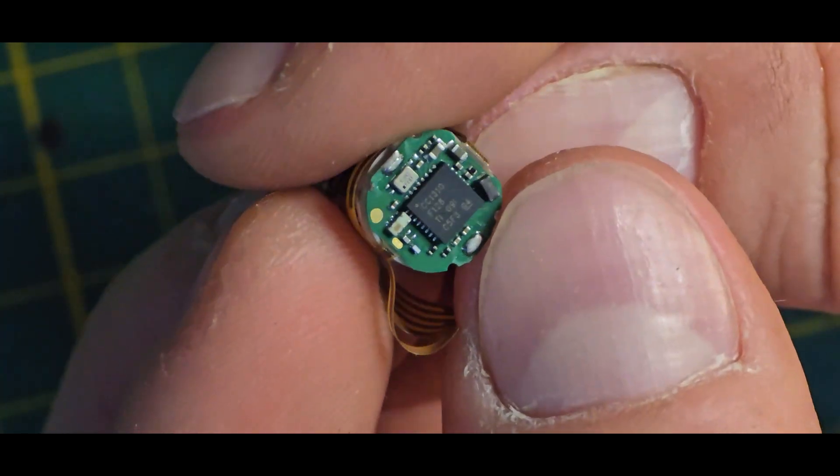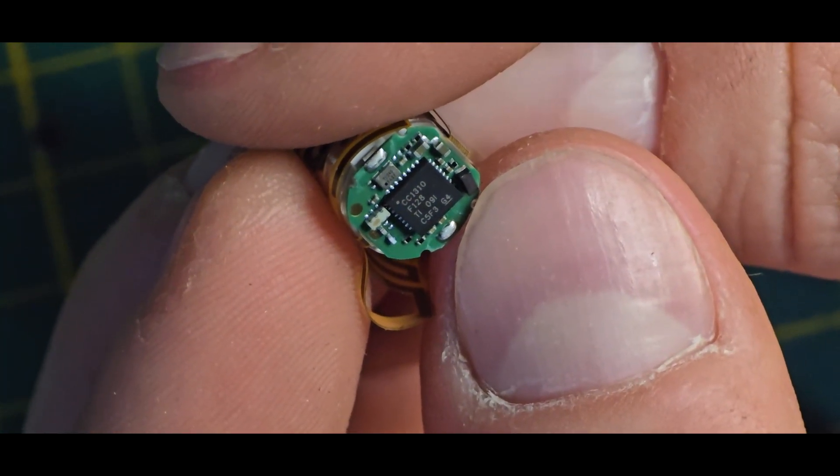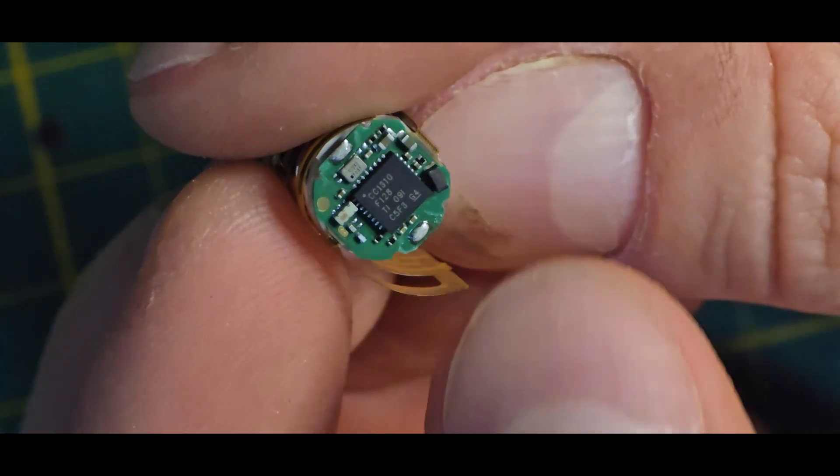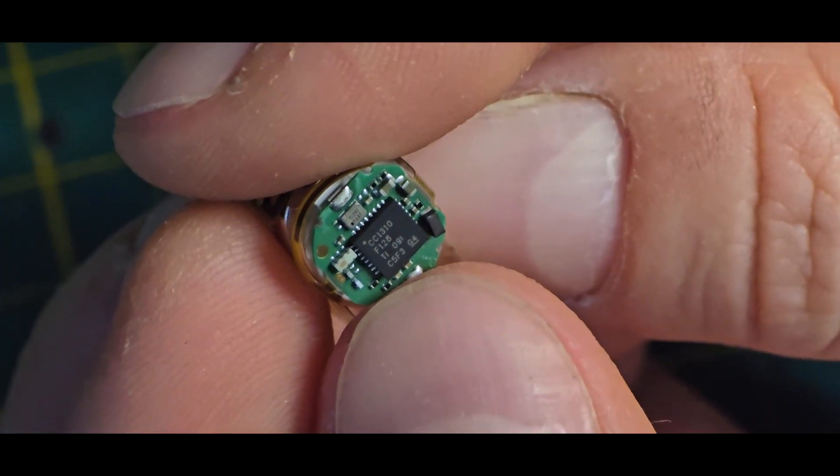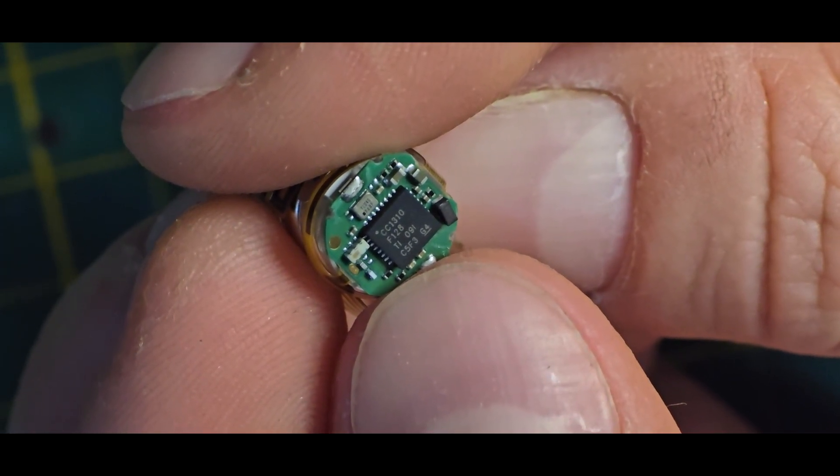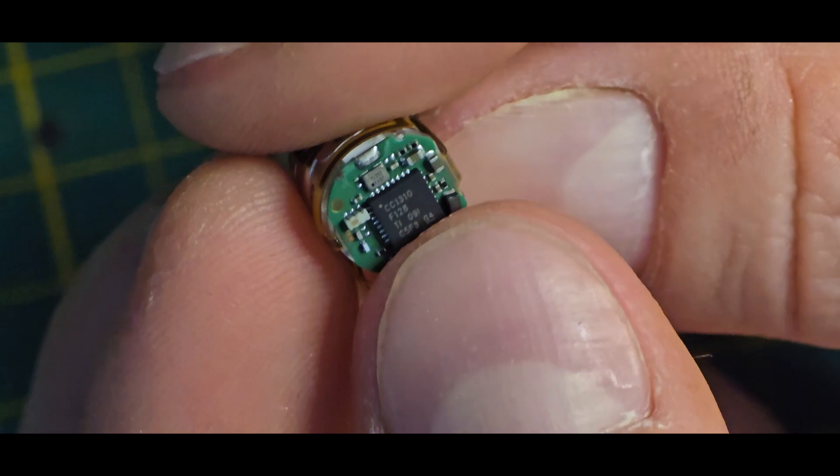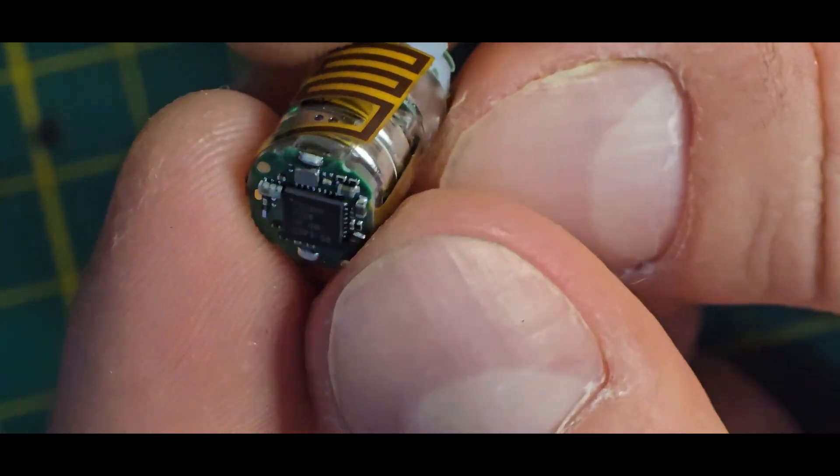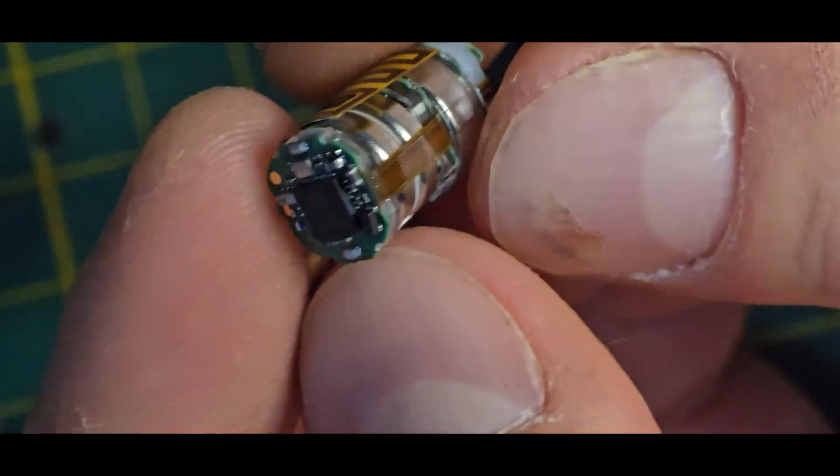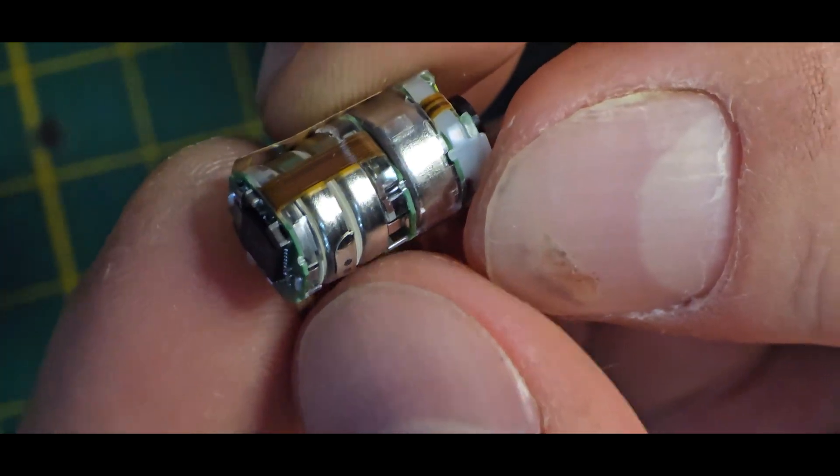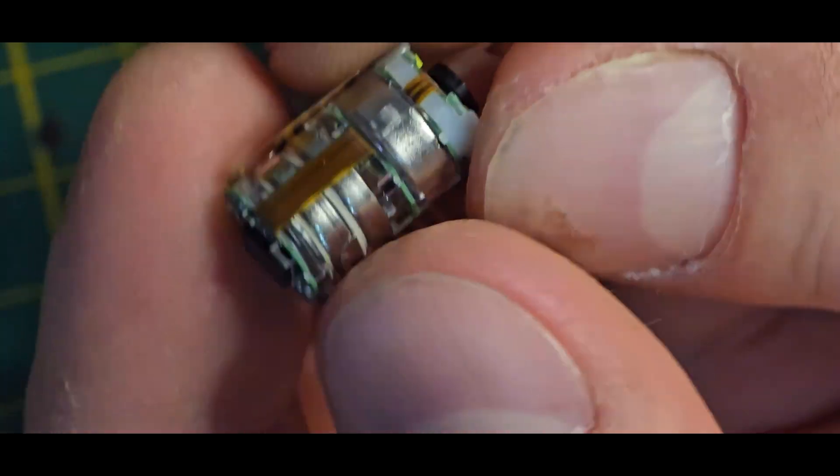Oh and nice, you can see a microcontroller already. Very nice, that's a Texas Instrument CC1310 which is basically a normal microcontroller and if it's not locked we even can read out the firmware. Okay this is interesting definitely.